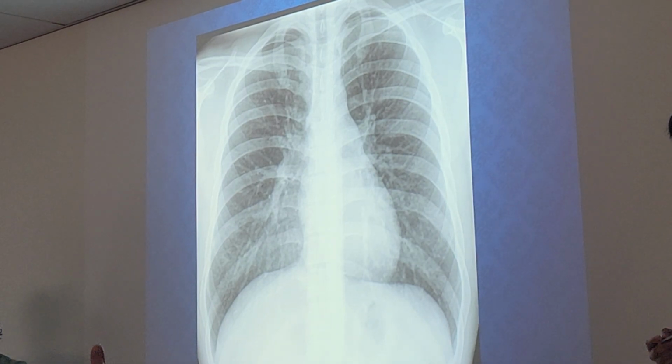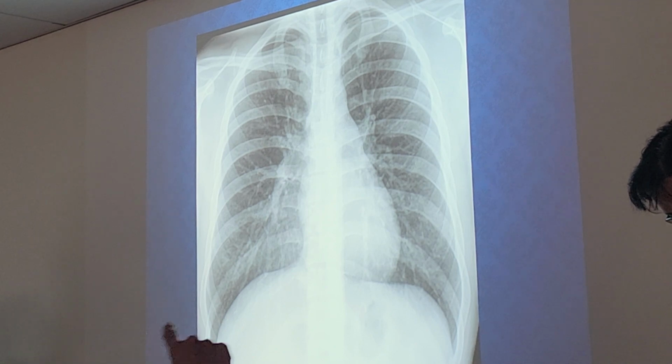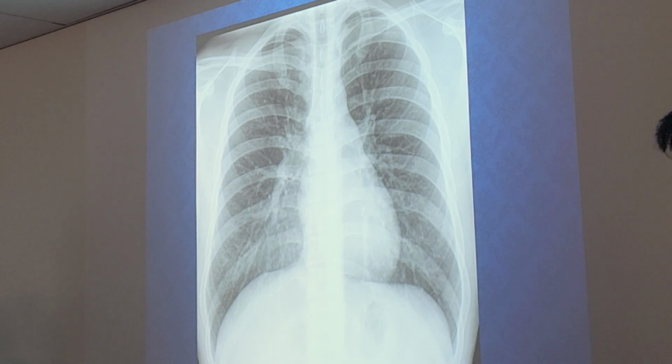Mr. Fong, can I ask you a question? So if the ribs at the back are going downwards, then we know that's a PA, right, sir? You can reasonably assume it's a PA. And then when we see the L on the top, we say that it's a PA projection, but it has been flipped.